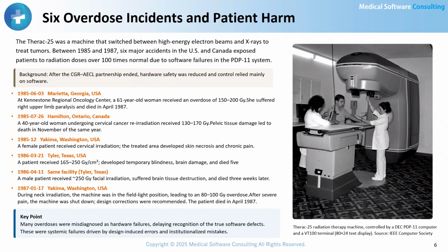April 11, 1986, Tyler, Texas. Just weeks later, another patient was killed at the same facility. Despite an error message, a beam of about 250 grays hit his brainstem. He died within 3 weeks. The cause was the same uncorrected race condition.